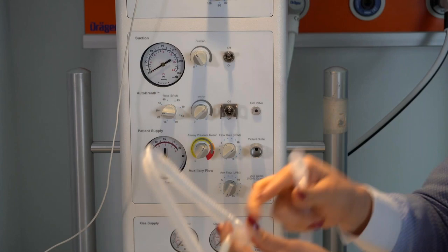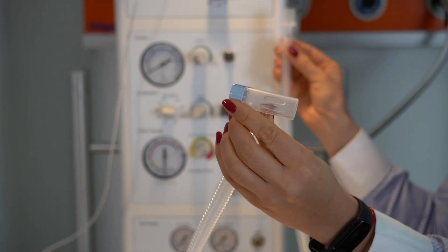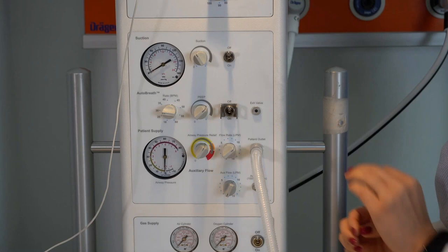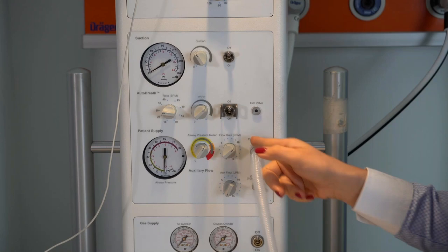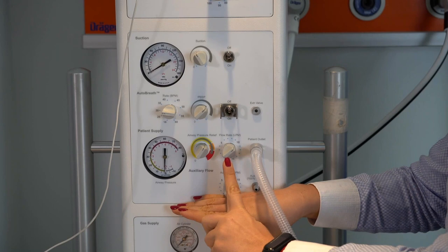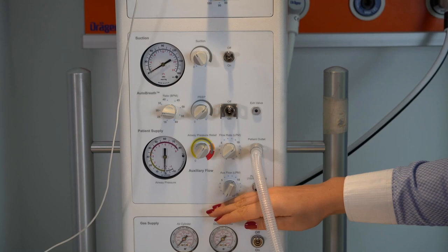Let's remove this. For T-piece resuscitation, you see here, this is our T-piece resuscitation circuit, and we connect it into the patient outlet. So the connection is pretty simple. It is written patient outlet. And then we can do the settings of the required parameters. So we can set the airway pressure, and we can set the flow rate. And we also have the possibility to monitor the current pressure that is delivered to the baby.